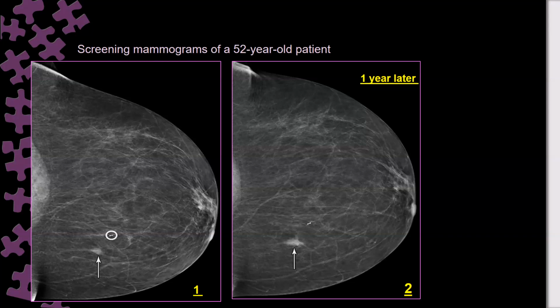You have to comment on that first. So from the beginning, I might not be with you. You are calling me by phone, and you have to tell me you have two images for this patient, only craniocaudal views. One is a baseline and the other one after 1 year.